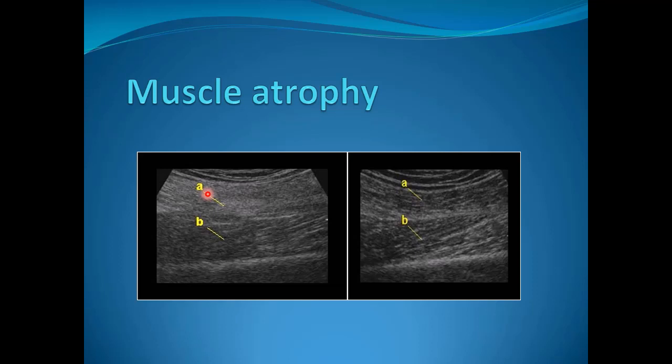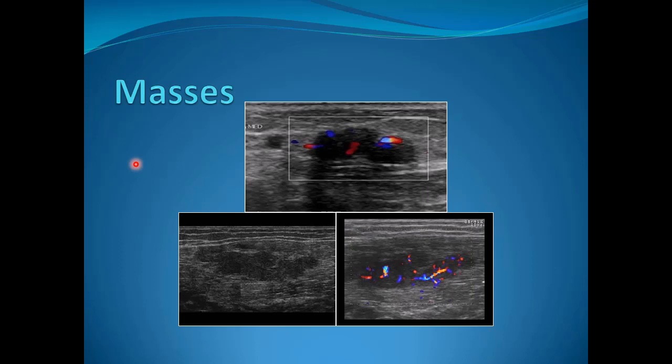This is an example of muscle atrophy, showing increased echogenicity of the muscle compared to the normal side with a slight decrease in bulk. This can be seen in patients with repeated traumas, particularly athletes affecting a particular muscle, or in patients with generalized muscle myopathies.